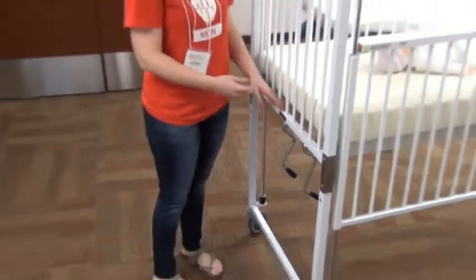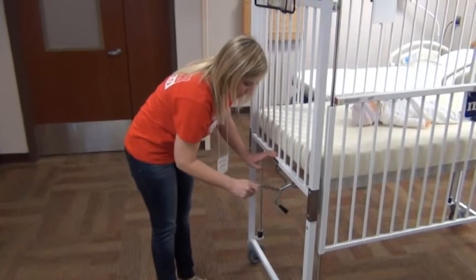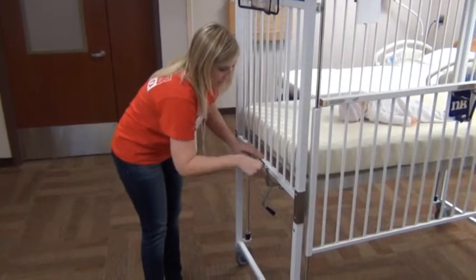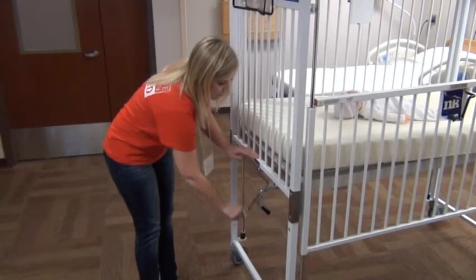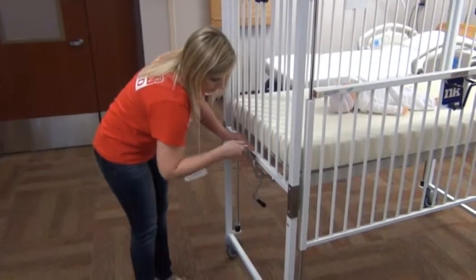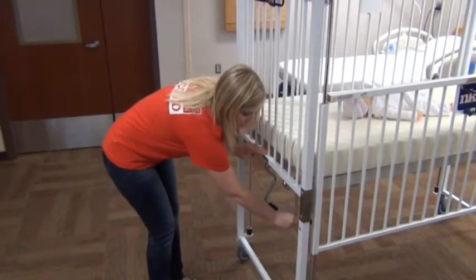And also, if you need to elevate the head of the bed, you're going to pull out this handle and then rotate it clockwise, and you'll see the head of the bed start going. When you're done, you'll go the opposite direction, and then you'll stop at this position and put the handle back underneath.